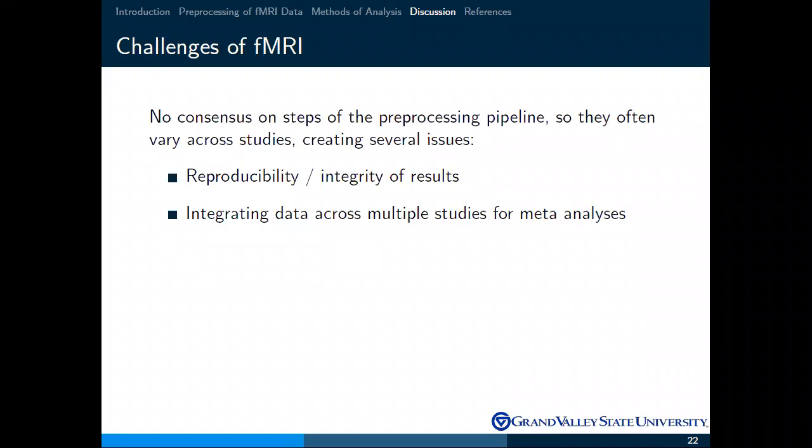And I don't mean to be doom and gloom about this, because there's a lot of people who recognize this as being an issue as well and have done entire research studies on what are good pre-processing steps, and here's how you should do it. Like Johns Hopkins University has some professors, Dr. Martin Lindquist, who's done some great work on calling out this issue and proposing solutions to selecting a pre-processing pipeline.